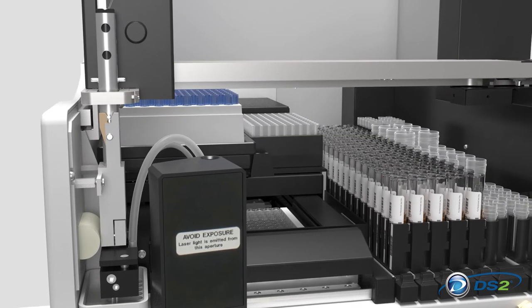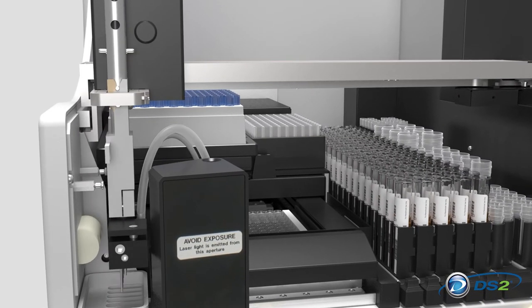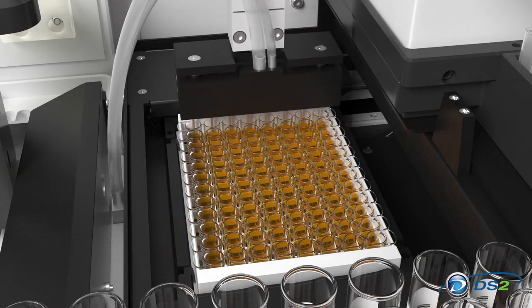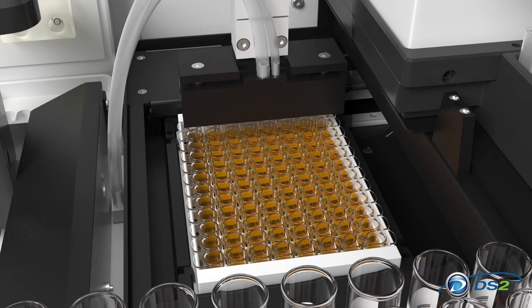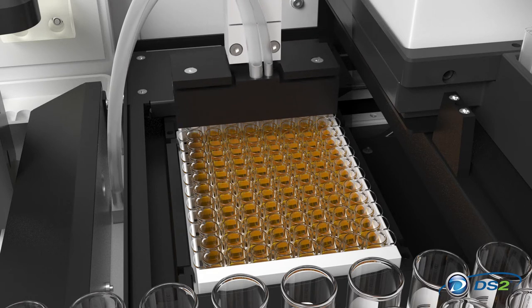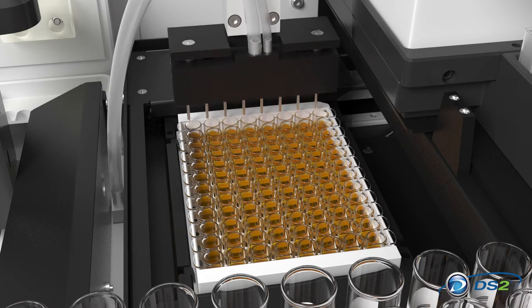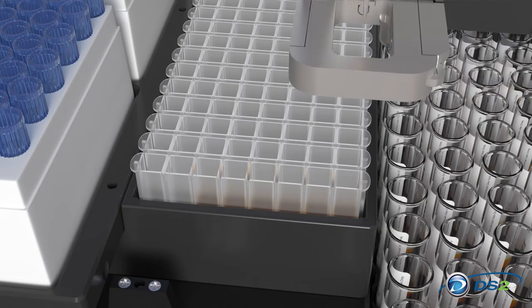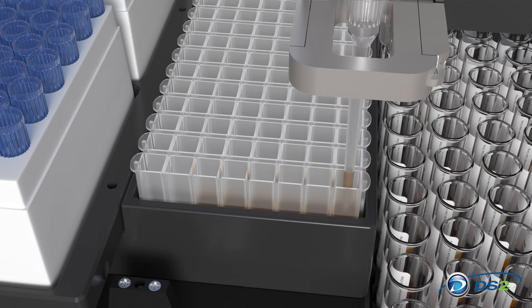The DS2 frees lab personnel from labor-intensive manual testing. Tasks performed automatically by the DS2 include sample dilution and serial dilutions, an important feature for many research applications.